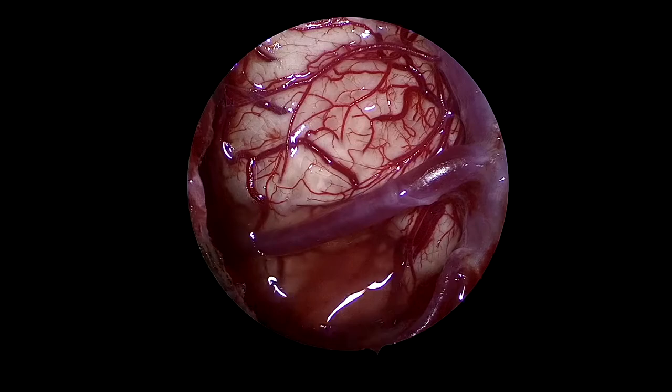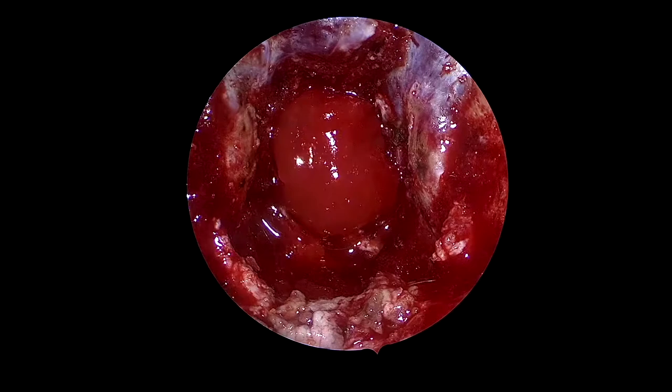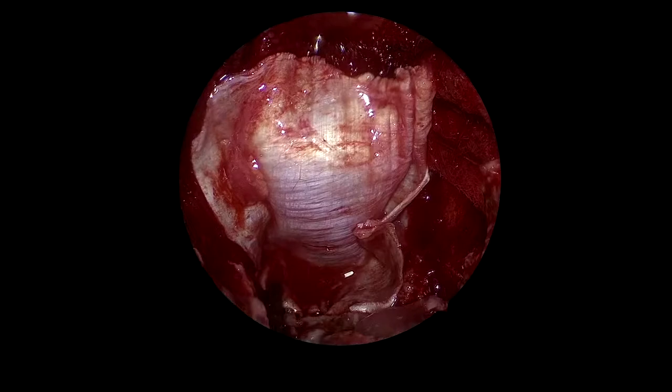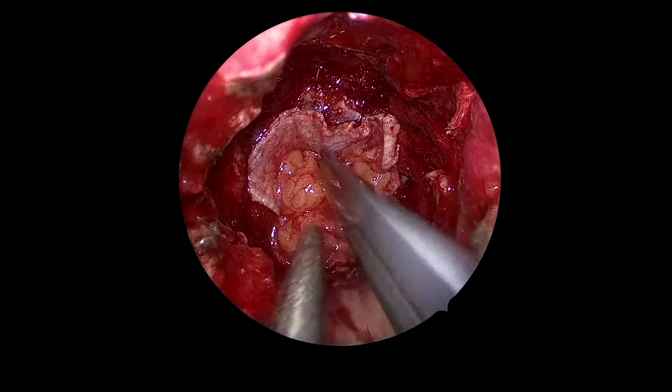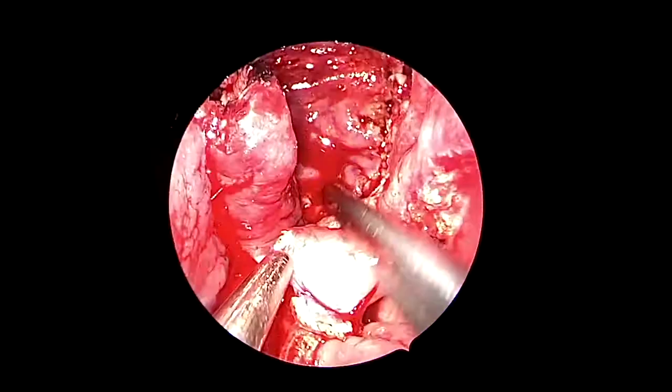The reconstruction is done in multiple layers. First, an inlay layer of Duragen that has to be placed in a near-watertight fashion. Then we use a fascia lata graft, placed in an onlay fashion, covering all the skull base defect, and bolstered with a fat graft that occupies the clival recess. Finally, we place our extended nasoseptal flap.